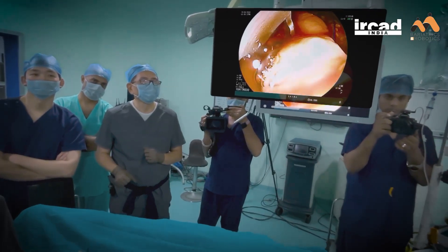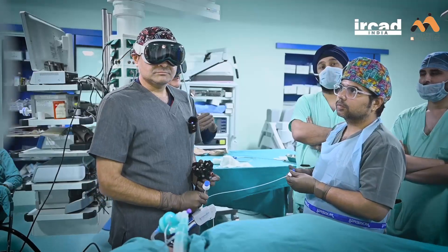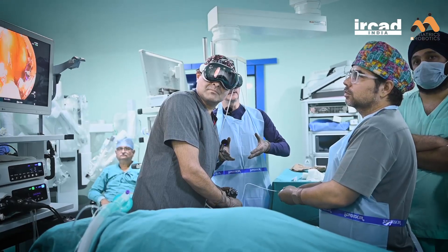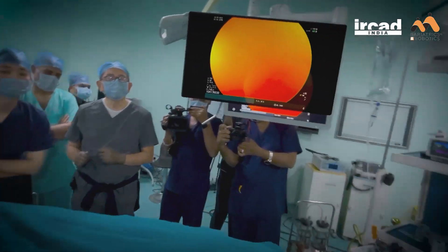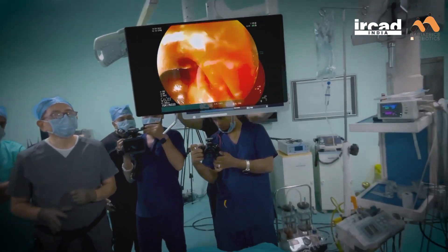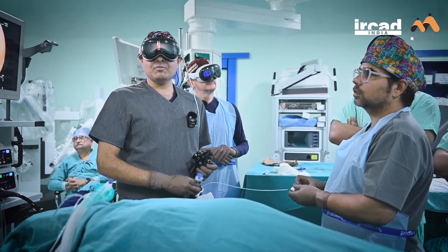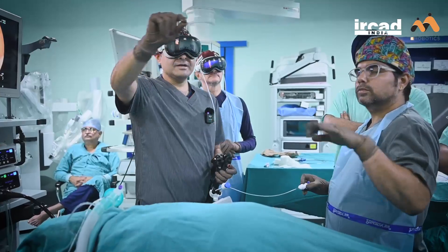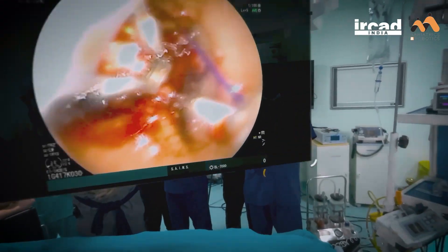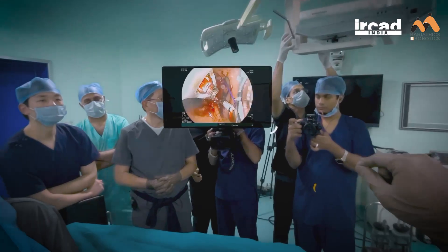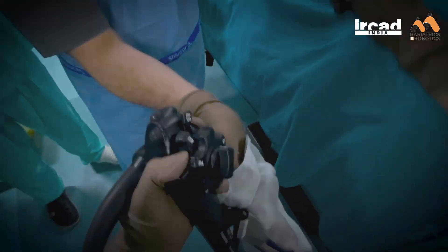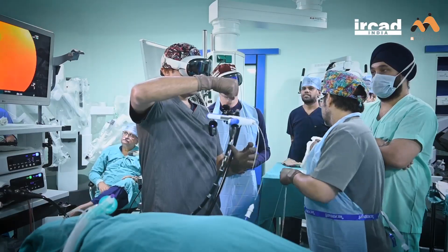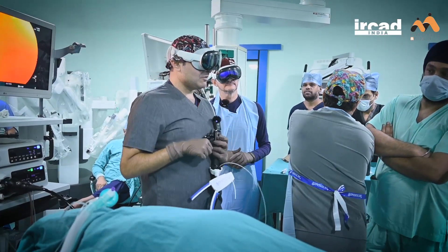We are revising endoscopic suturing — it's one of the things that we do here at Mohawk Center and in India. Mohit, the hand-eye coordination — absolutely nothing is missing on that. And plus, I can take this screen anywhere: here, here, here. I can increase the size of the screen, decrease the size of the screen, and you can see that I have full control.